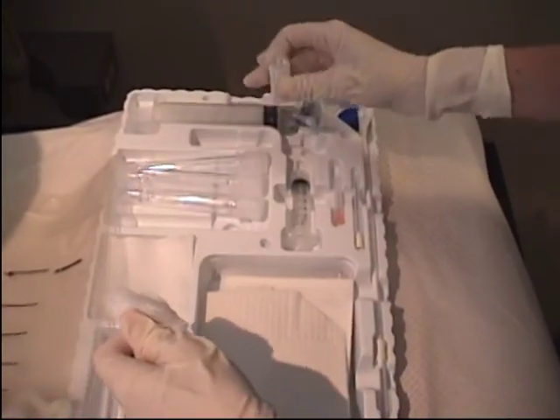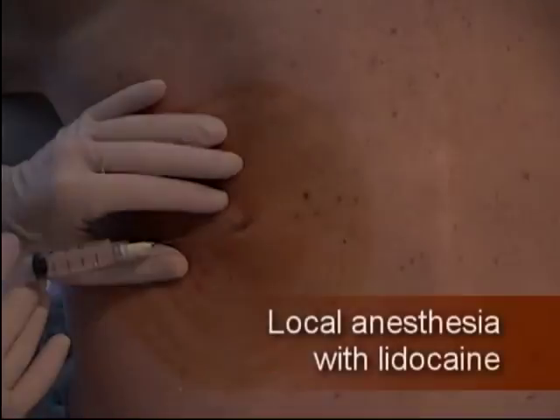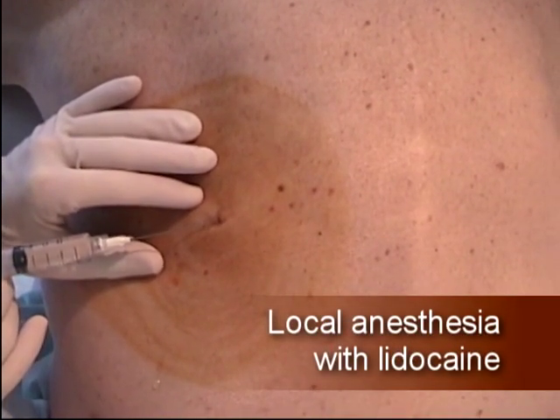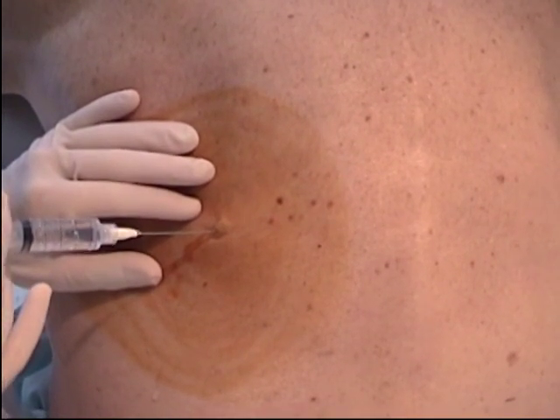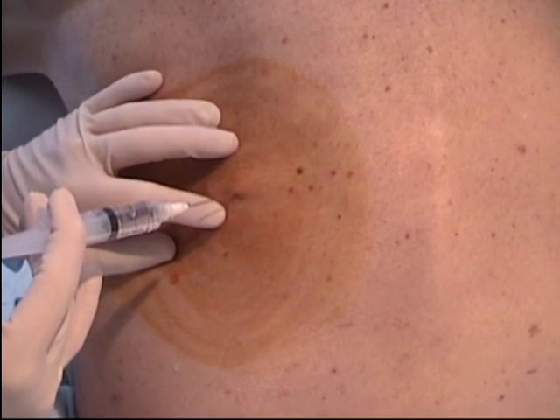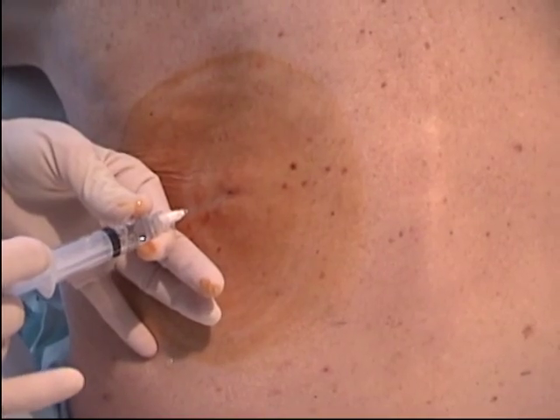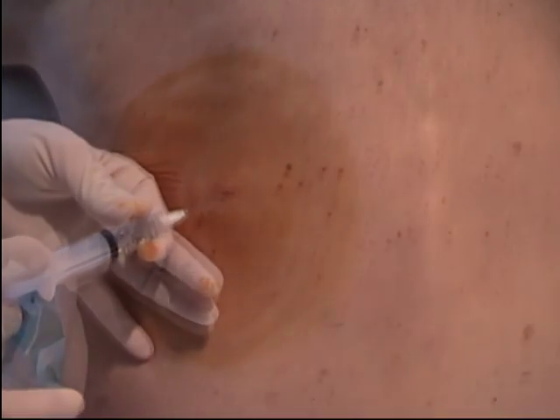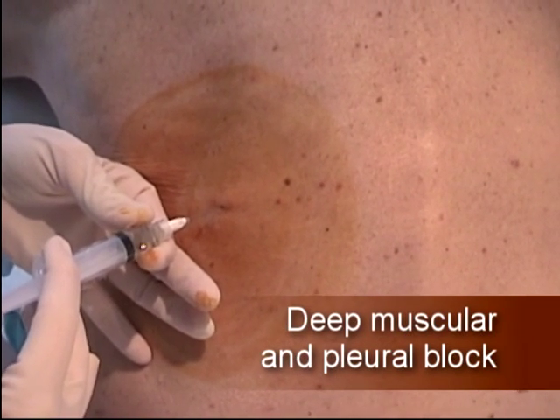Draw up local anesthetic into a syringe using a 23-gauge 1.5-inch needle to inject the anesthetic. After creating a superficial wheal, pass the needle deep into the intercostal muscle and inject 1 cc. Advance the needle 1 centimeter at a time, injecting 1 cc of anesthetic each time to anesthetize the deep layers superficial to the pleura. Apply negative pressure to the syringe while advancing it.